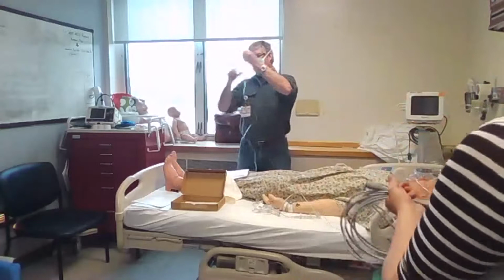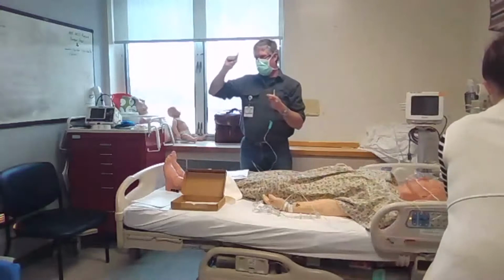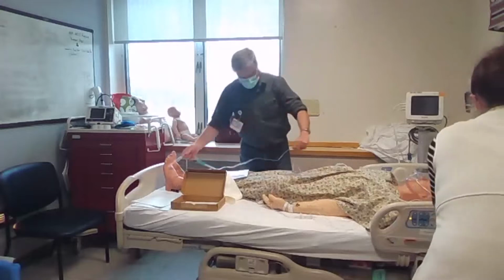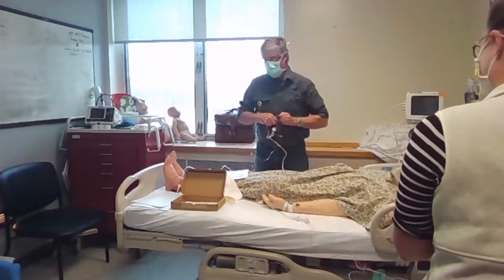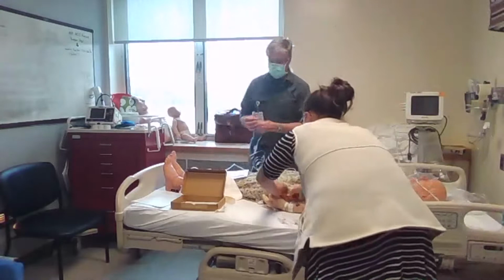You spike your bag. You have it in the pressure bag already, spike it, and then you put the pressure up. You put the pressure up until you get the green band. I think it's like 300 millimeters mercury, something like that. And then you do the rest. You do that before you prime the tubing? You're gonna prime the tubing next, yeah.